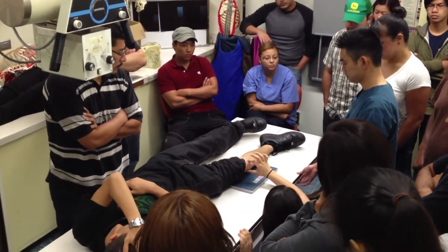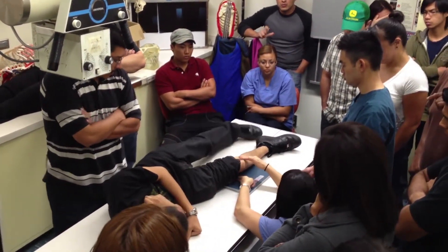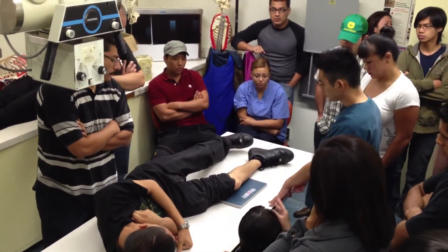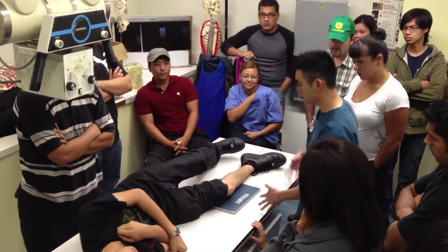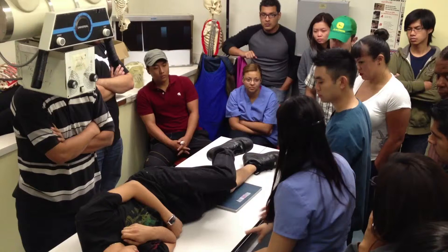You want to say okay, or like what he does — put your knee up and say okay, come down onto my fingers. If you're not sure, you can get down and visually see where it's at. Skinny people can do this easily, but bigger people need to rotate their hips because they can just do it like that.